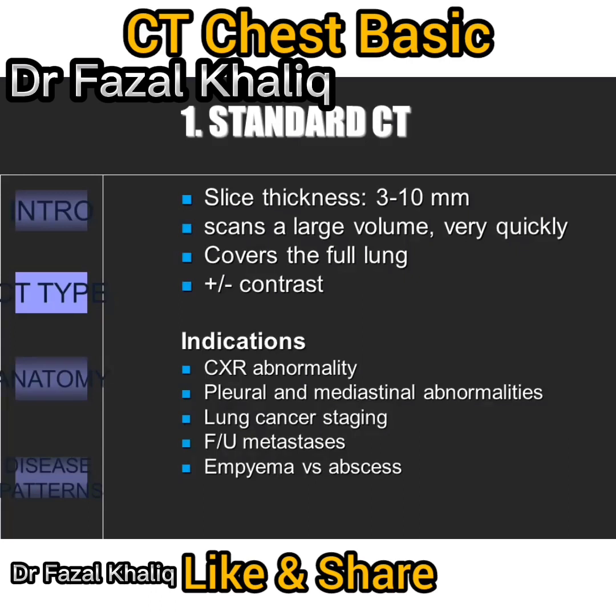These scans are very useful in emergency rooms where a fussy child or a delirious adult needs a critical chest image. The advantage is that the entire helical CT scan can be done in less than a minute. Usually these patients can stay still for that period of time. The images in a standard CT can be obtained with or without contrast. The indications for chest CT are numerous. Here is a short list.